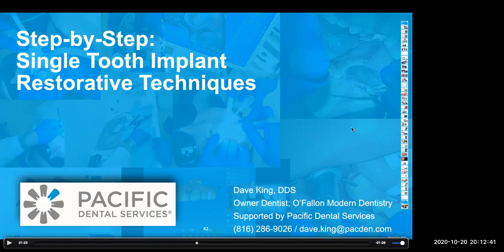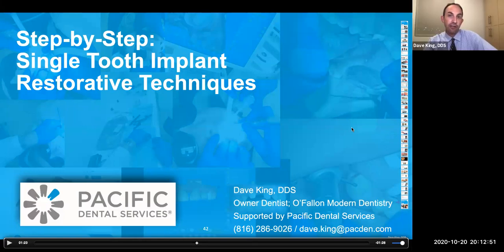All right, and one last question. When you're doing full arch implants, don't you want to over-engineer in case a couple implants do fail? You bet. Yeah, you definitely want to over-engineer. Like I said, 6 is probably going to be better than 4, but going beyond 6 isn't always necessarily better. On the lower arch, though, we have a much lower incidence of implant failure with 4 implants, just because of the nature of the bone, the quality of the bone.